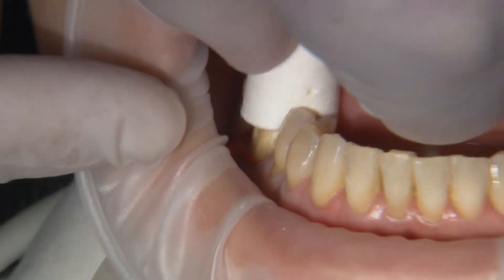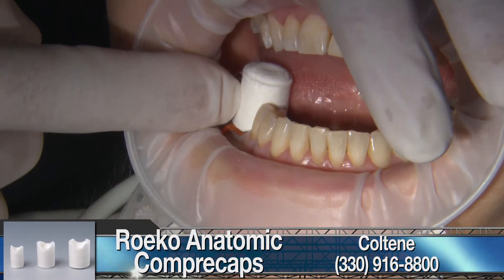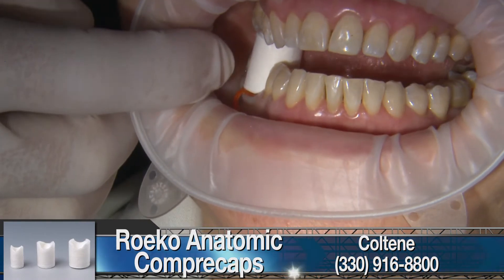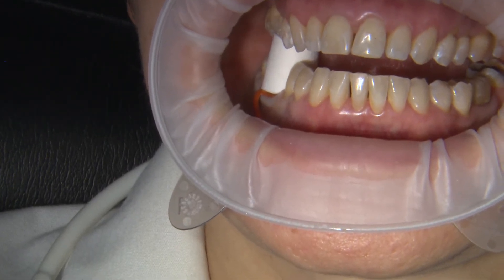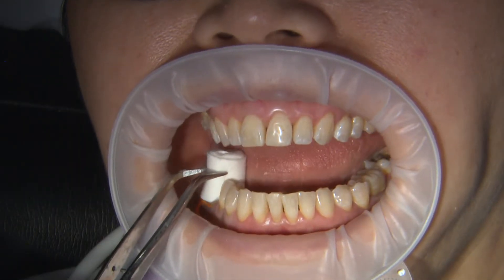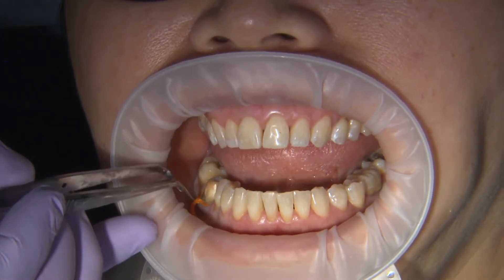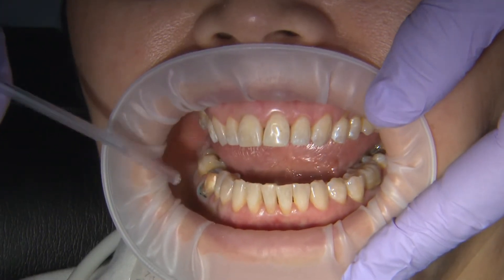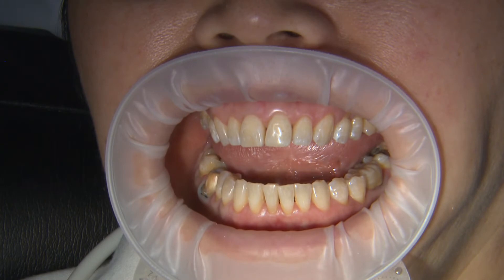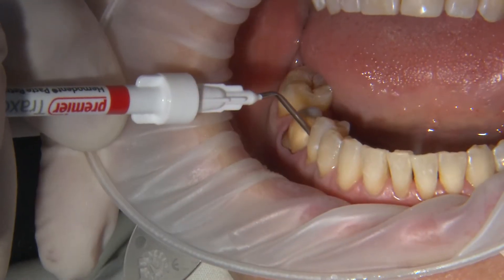As a secondary retraction step, a compression cap can be placed and bitten into for two to even seven minutes. These caps come in a variety of sizes as well as anatomical designs that will help to hug the gingiva cleanly. After the patient has bitten on the cap for the appropriate amount of time, it can be removed and the top cord taken out as well. Give the tooth a quick air blast to remove debris or saliva and check to make sure the remaining cord does not cover the margin at all.